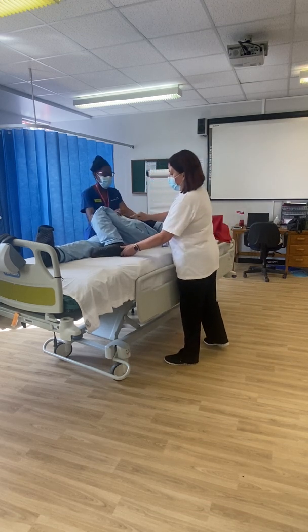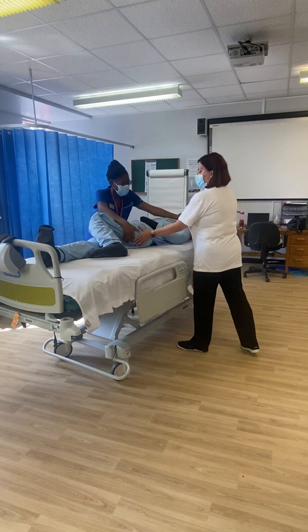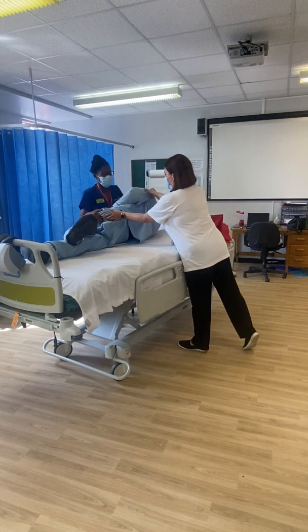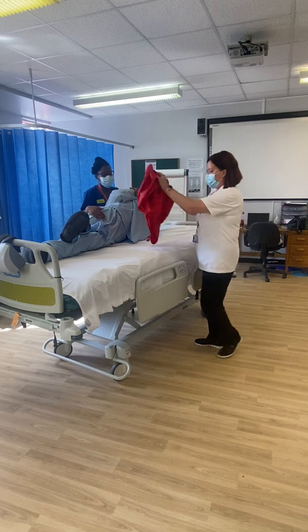Priscilla is then going to put one hand across on the hips and the other hand on the shoulder, and I'm going to match the same, and we're going to use that same weight transfer technique. We're going to go on the command ready, steady, go, okay? Ready, steady, go. And again, Priscilla's going to support him inside lying.